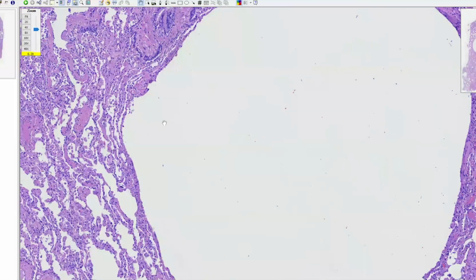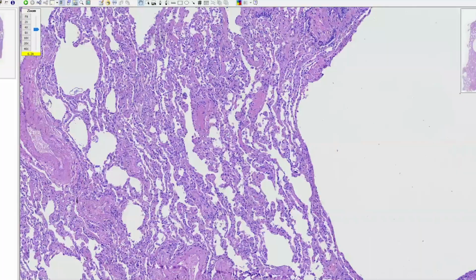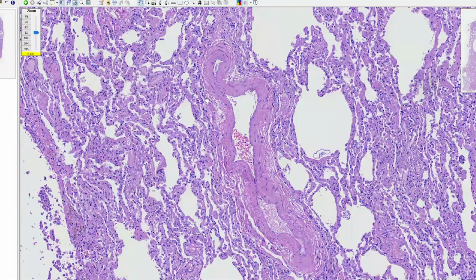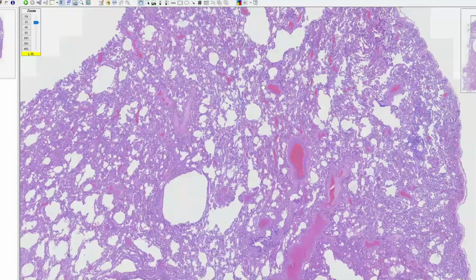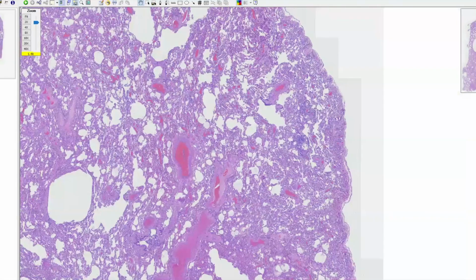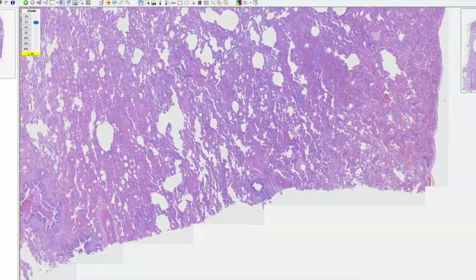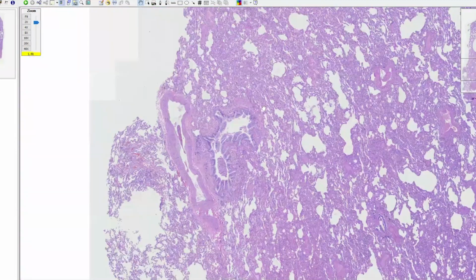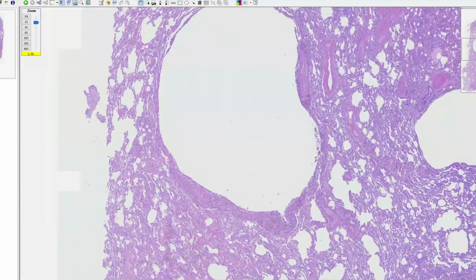There are these relatively well-formed cysts in the middle of otherwise relatively normal lung parenchyma that are distributed throughout it here. Some of them are a bit closer to the pleural surface. You can see them all throughout here. So these are relatively nondescript cystic areas throughout the lung specimen without any abnormal spindle cell proliferation associated with these cystic areas.